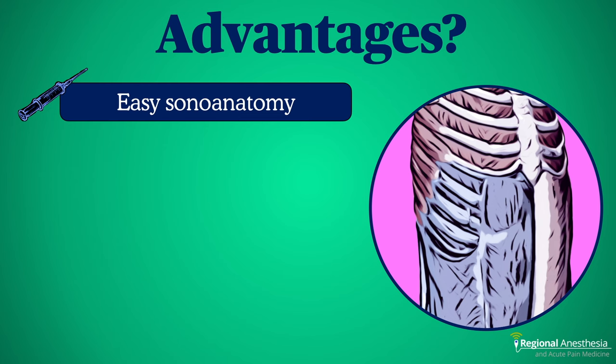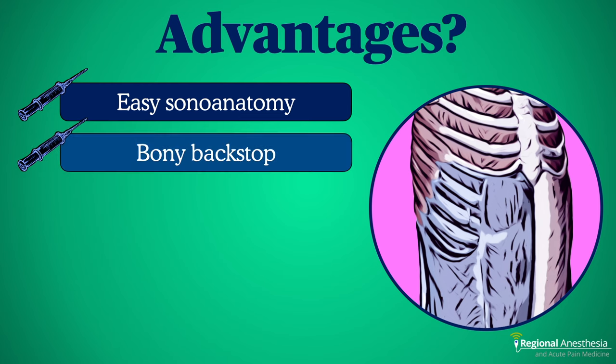It's also nice that the patient is supine. We'll often do this at the end of the case, and unlike an ESP, paravertebral, or anterior QL block, we don't have to get the patient up on their side. Similarly, there's a bony backstop. Unlike the TAP block, where it can be frustratingly challenging to open up that intermuscular fascia plane, this plane peels up off the ribs easily. I'll typically land my needle on the seventh rib, and my test injection with saline lifts the muscle off on the first try, more often than not.